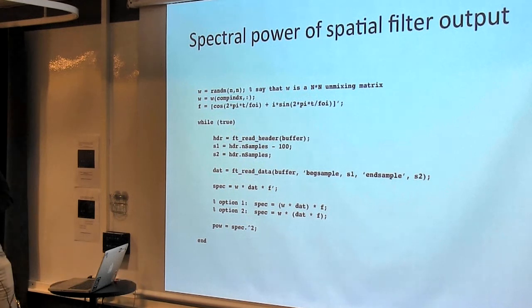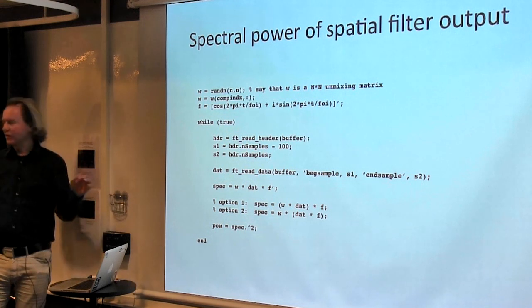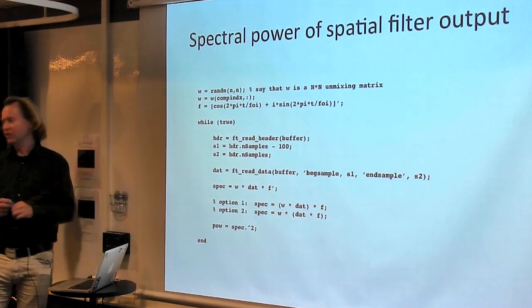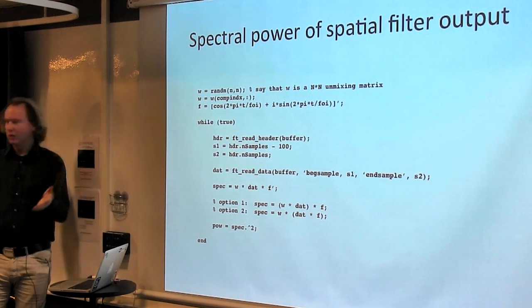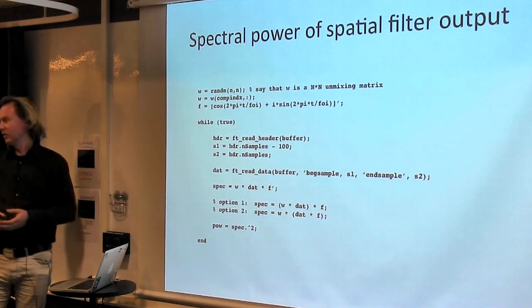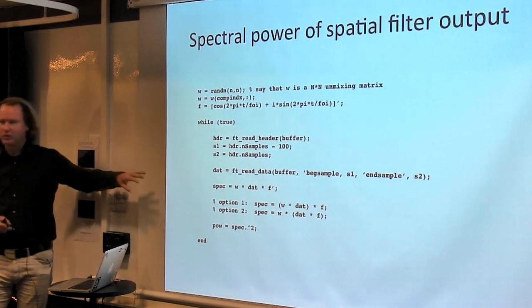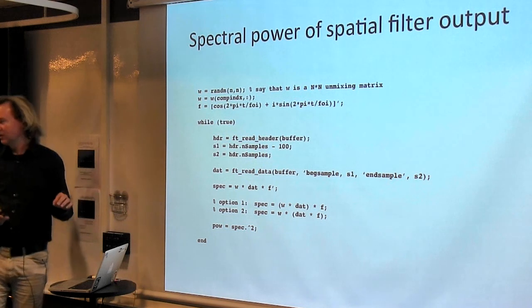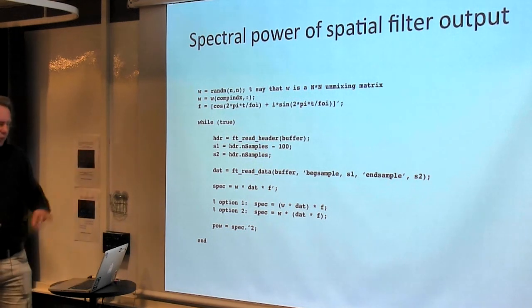Depending on the number of channels that you have and the number of time points, one of them is going to be faster. So even thinking about how you put the brackets in your equation is going to make it faster. And this might be a level of detail that's not really relevant for you. Like if it's fast enough, then just use it. Okay? But this is just some tricks that you can exploit in making computation run really fast.